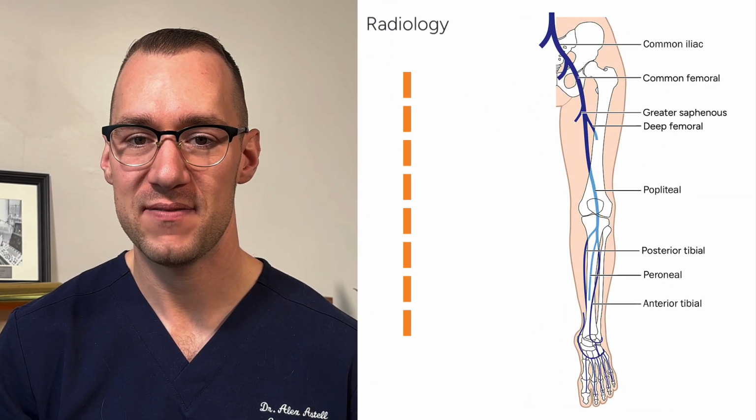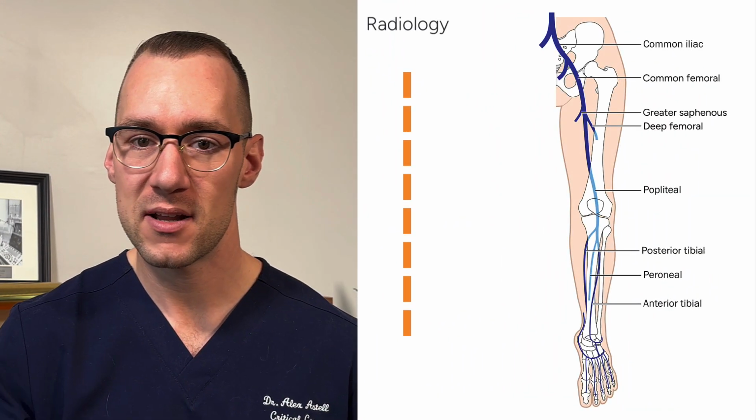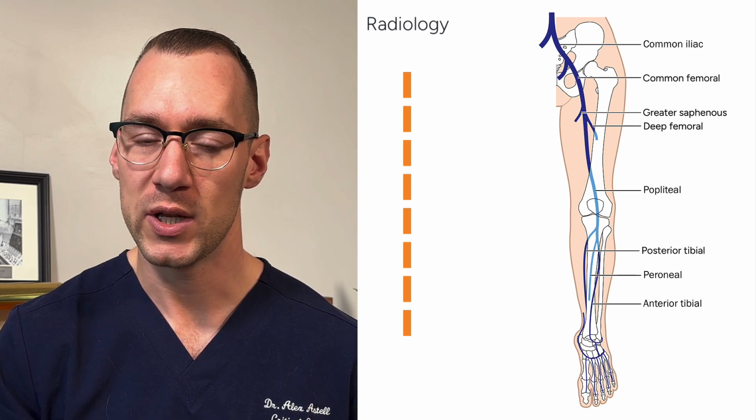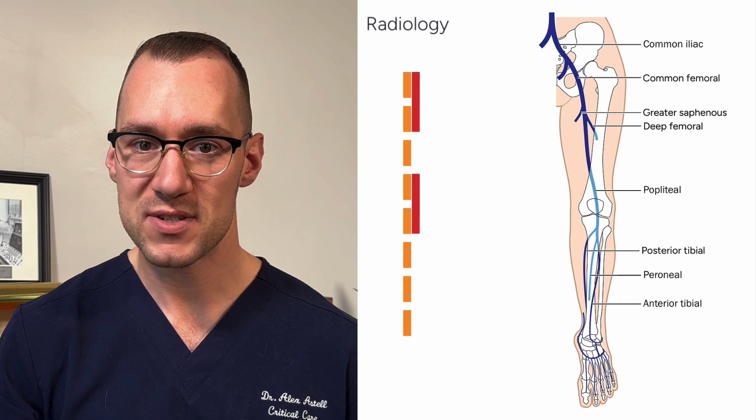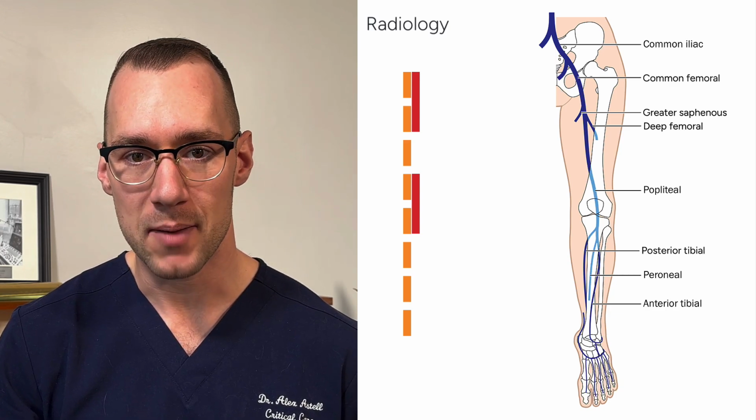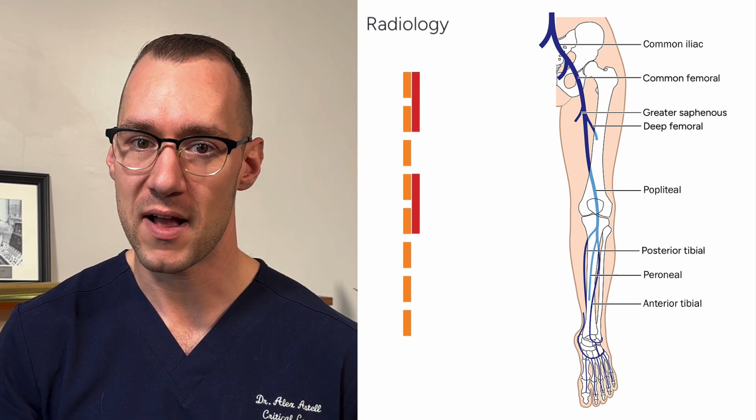in this video. Ultrasound is the imaging method of choice for assessment of DVT, given its ease of use, speed, and cost. This has made DVT studies a natural addition to the POCUS provider's toolkit. Radiology guidelines recommend a complete assessment of the deep venous system from the inguinal ligament all the way down to the ankle, including Doppler of the common femoral and popliteal veins. While this represents a gold standard, it takes some time, so more focused protocols have been developed.